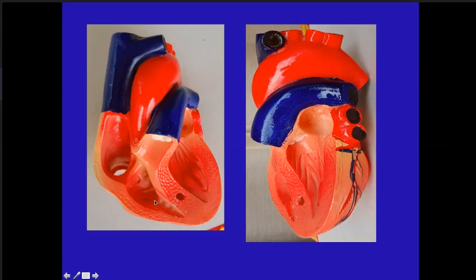Again, in the left ventricle, can you see the septum is curved? If you take a horizontal section, it is curved like this. And if you take a longitudinal section, it is curved like this. So if you have a VSD in this location, you will need a different projection to profile it than if a VSD is in this location. Okay?